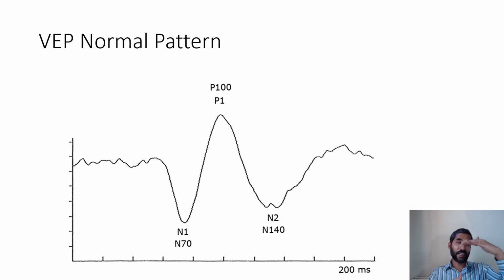That is, you take a lot of stimuli and the EEG corresponding to each stimulus, and then you average them. We'll talk about this in just a moment. When you take these ensemble averages, you get this nice shape, so that you have lost all the noise and you're just keeping the shape that is in response to the stimulation.